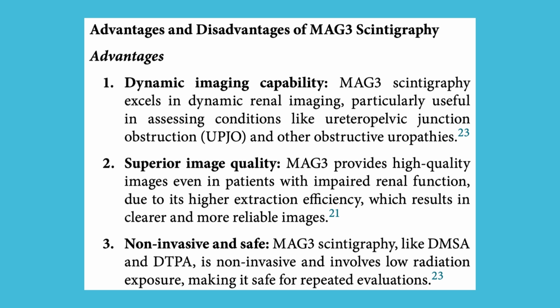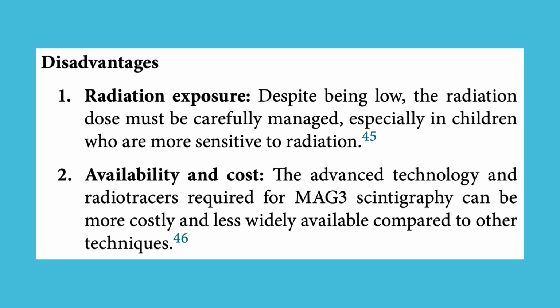3. Non-invasive and safe. MAG3 scintigraphy, like DMSA and DTPA, is non-invasive and involves low radiation exposure, making it safe for repeated evaluations. Disadvantages. 1. Radiation exposure. Despite being low, the radiation dose must be carefully managed, especially in children who are more sensitive to radiation. 2. Availability and cost.